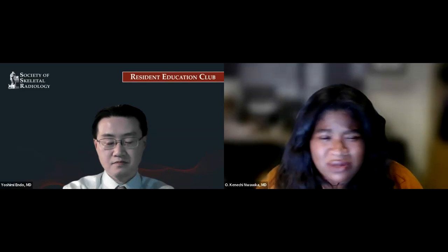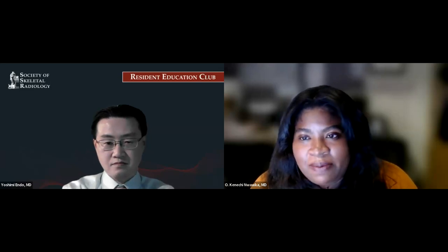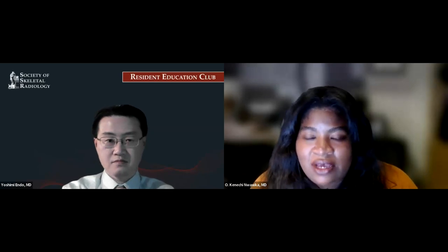Is the Achilles torn? Is this ligament torn? If a patient comes in and you're saying they have generalized knee pain, please do not request a musculoskeletal ultrasound. It's really not useful to the patient, and it's time poorly spent by the radiologist to sort through all the structures in the knee. If they say the patient has medial knee pain, question MCL strain, or the patient has patella alta on X-ray, question integrity of the patella tendon, those are quick, easy diagnoses to make using ultrasound. They're always slam dunks. You don't have to equivocate on those diagnoses. Those are the scenarios that you can diagnose using ultrasound, and those are the things that they should be referring to you.